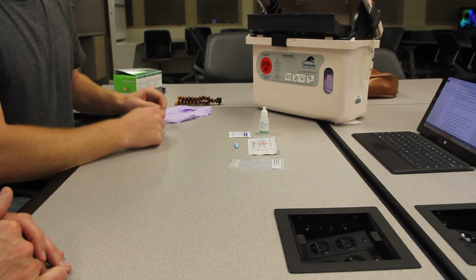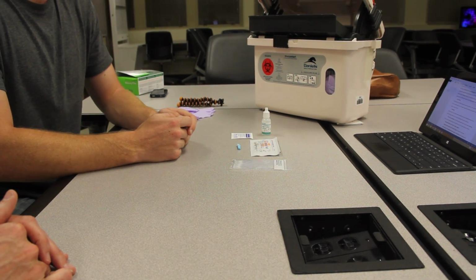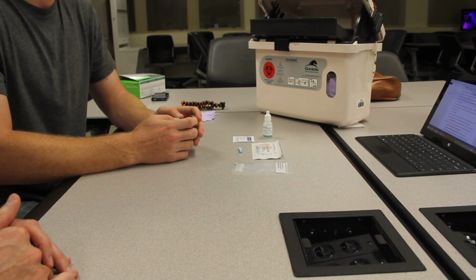Hello everyone, this video is a demonstration of the generic technique for using a lateral flow test. Today we'll be using the Standard Diagnostics Malaria P. falciparum / PAN test, which checks for both Plasmodium falciparum and general malaria infection.